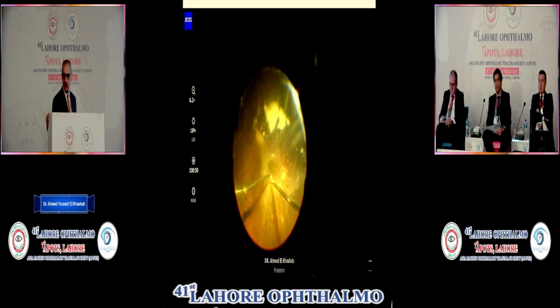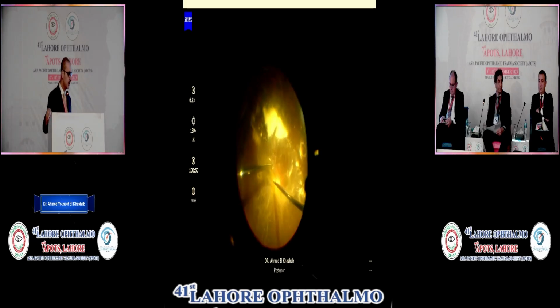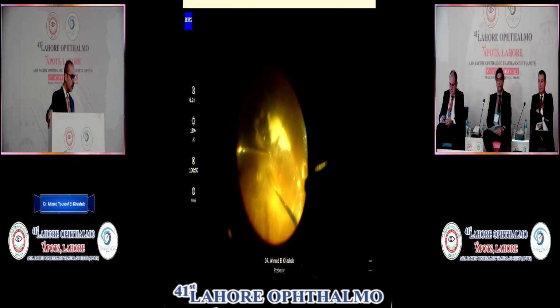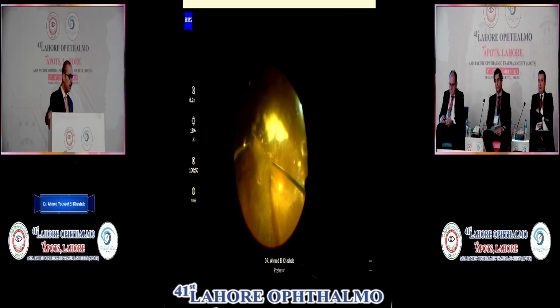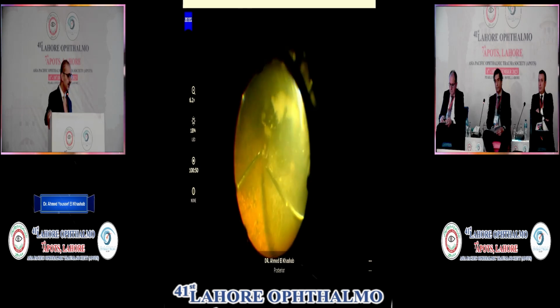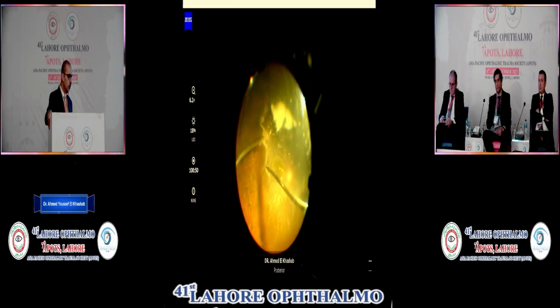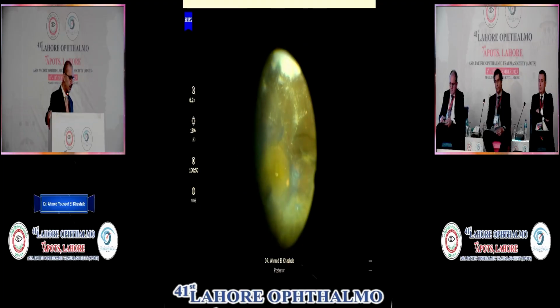Can we work the video, please? I saw that there is a still persistent epiretinal membrane, and I did not want to pull too much. So bimanual technique is essential. Although the membranes are not that tough, it is always better not to create more traction on the retina.